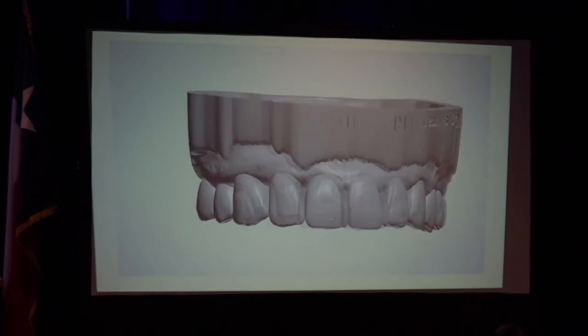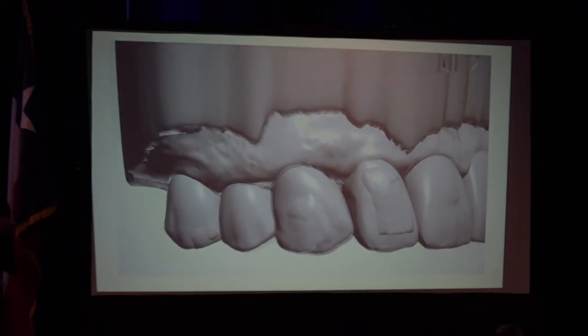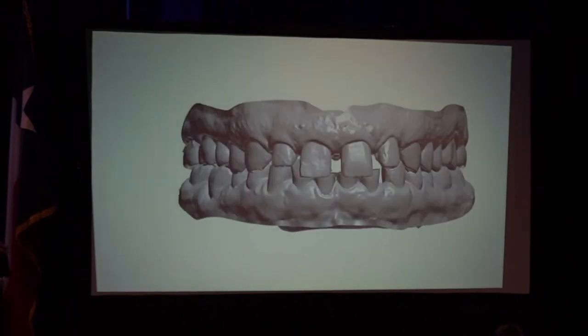You'll have a putty model, and then once, let's play this. Okay, you can see the ideal wax-up is a little bit behind there. It's a little bit recessed, and there are some parts sticking out, and you can see all that. So once you prep it, then you'll use an ideal wax-up and transfer that over. Okay, so two different ways, this is subtle. The first model allows you to see those things.